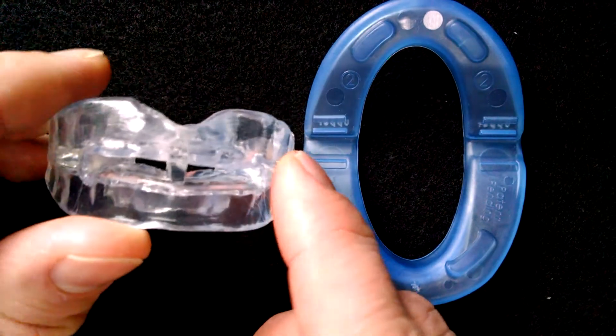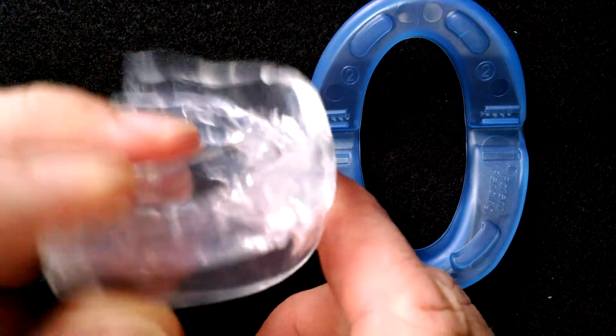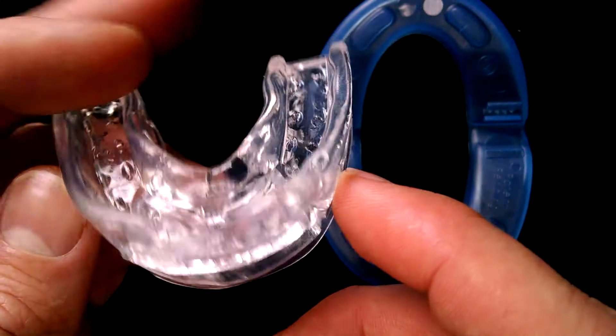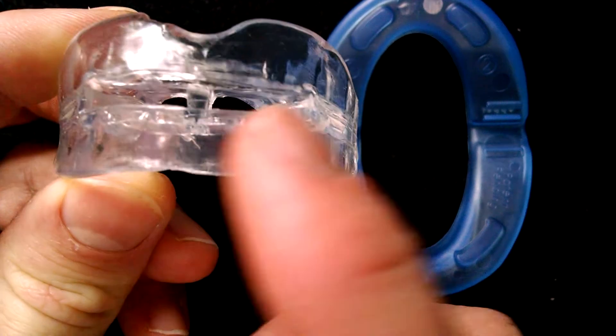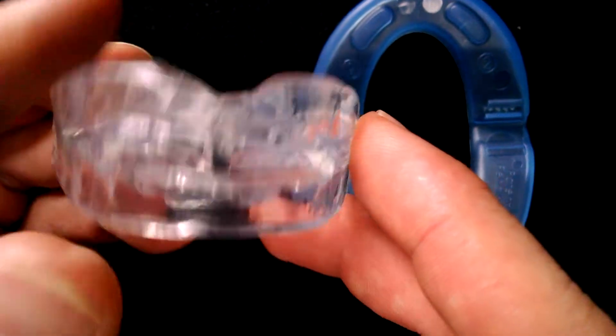The Rip Snore is also a mandibular advancement device but this is a simple boil and bite style. You can dunk it into warm water and then take an impression. This has a fairly large breather hole here at the front and the Rip Snore sells for $70 and that includes shipping.